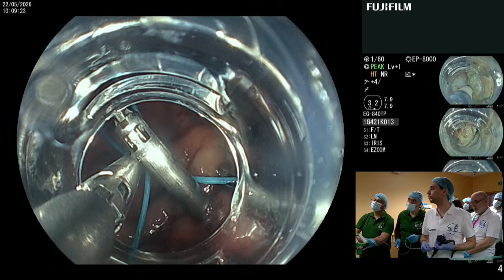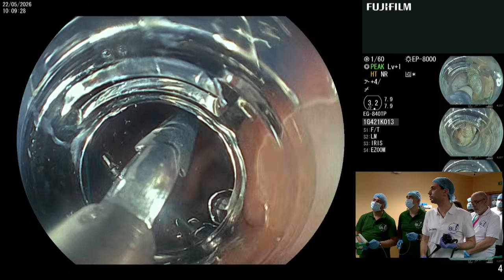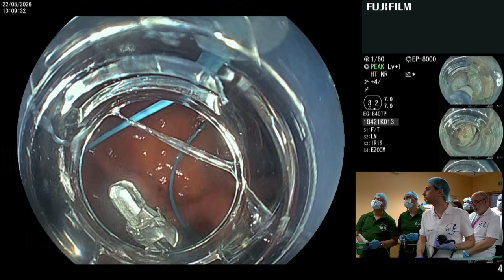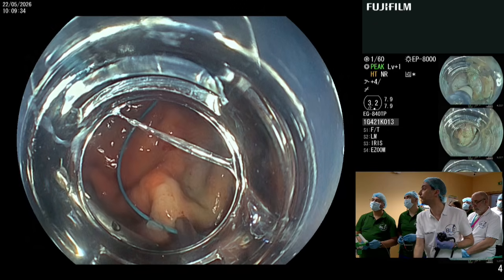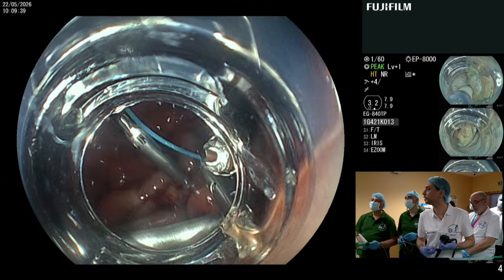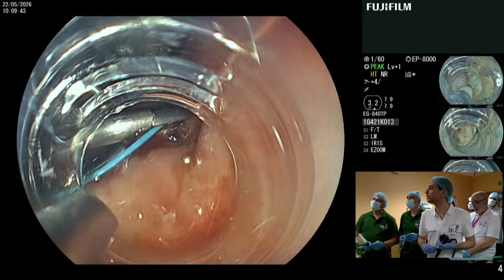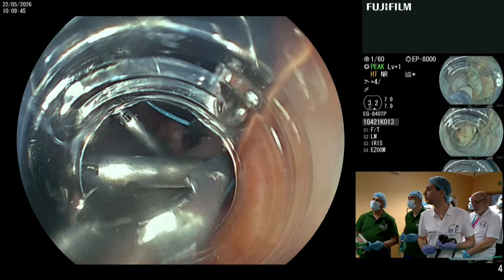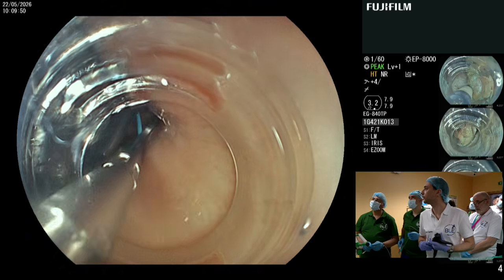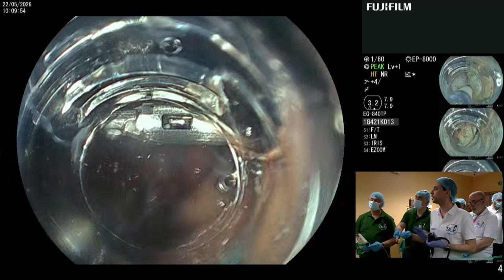Okay, step back. We have to understand what's going on. Open. We don't see well. Let's understand. All right. Yes, so I have to pull back my endoloop to straighten it. This endoloop has to be fixed here. Open. All right, here. Here is good. Open. All right, close. Fire. All right. So the right part is done.